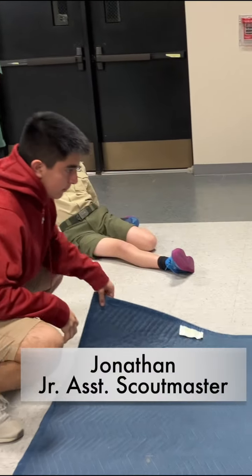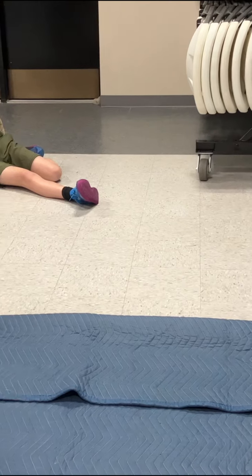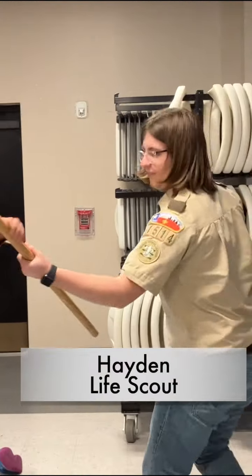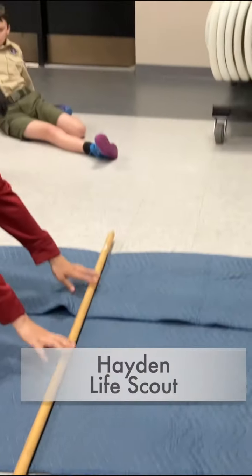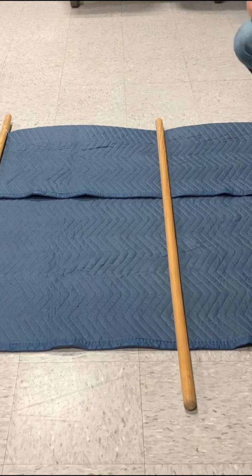We're going to fold it over a little bit, just for us to have handles right out there. We need it right there, about a third of the way. We want it to fit its body size, so we're going to fold the sides in there.